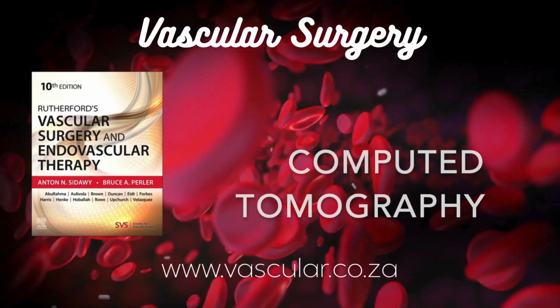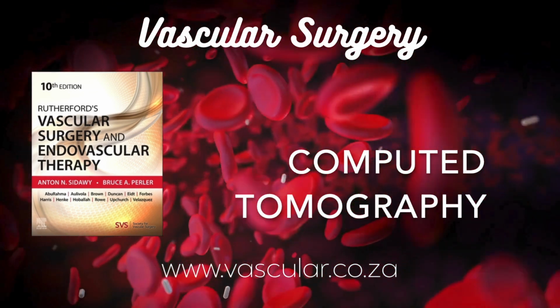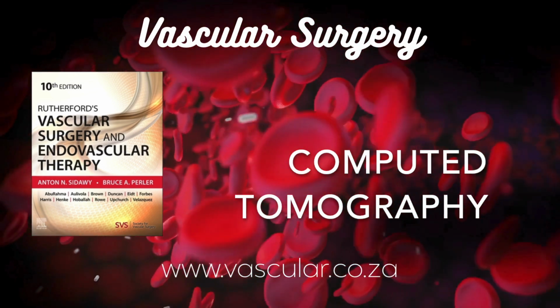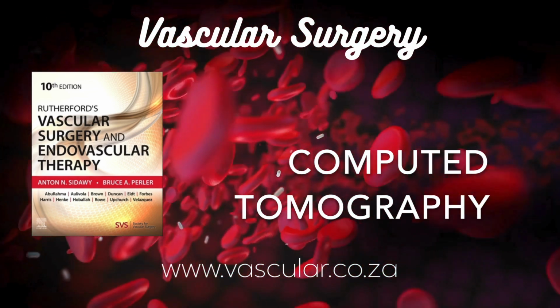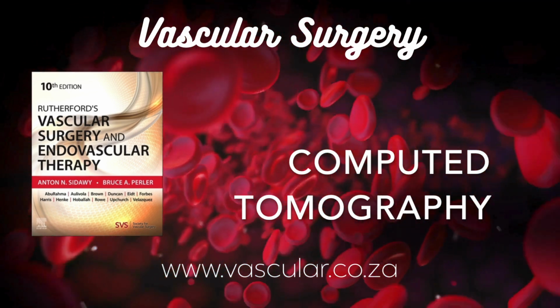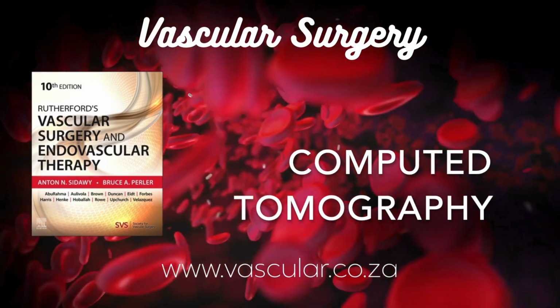You need to scan a whole region, like the chest or abdomen, while that temporary bolus of contrast is passing through the arteries or veins you want to see. So the timing has to be perfect. Spot on. Scan too early, the contrast isn't there yet. Scan too late, it's already washed out. How do they nail the timing? Modern scanners use clever software, often called bolus tracking or automated triggering.